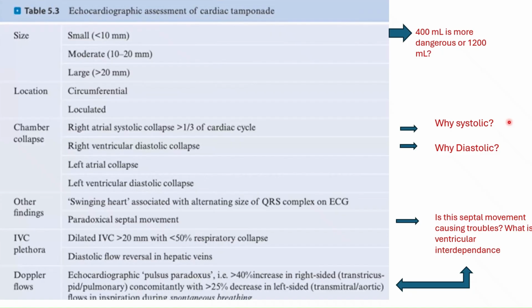So it means that you're decreasing the emptying of your blood towards the right ventricle because you don't have that blood already in your right atrium. So if it's collapsing at that time, it's a very bad sign, right? Because we know that filling of the RV goes down, eventually stroke volume comes down, and cardiac output is decreasing. So it means that patients will probably get hypotensive too.